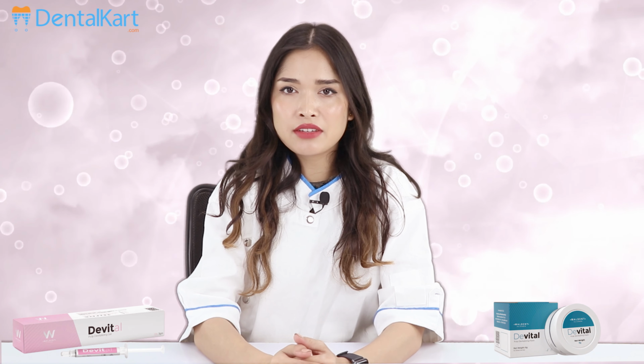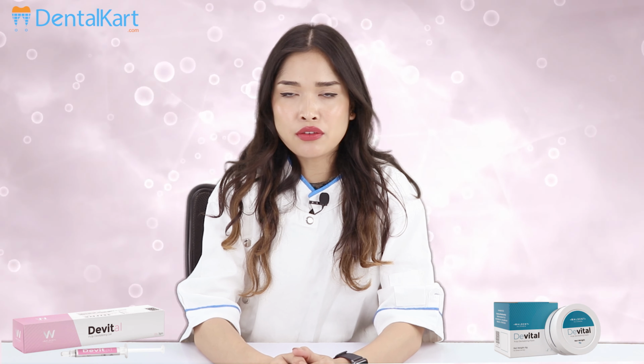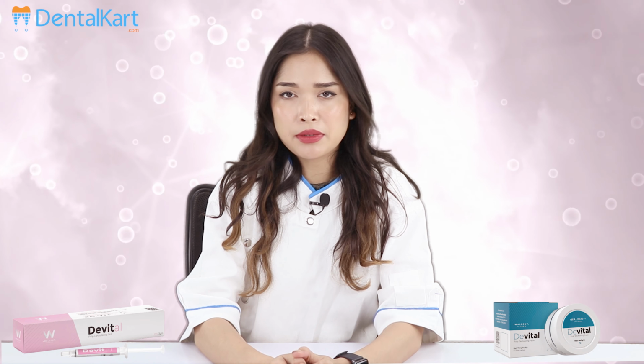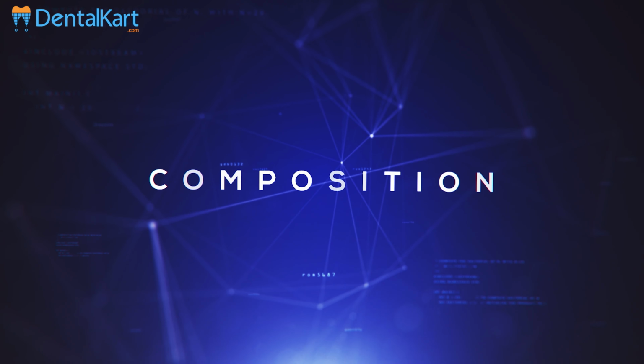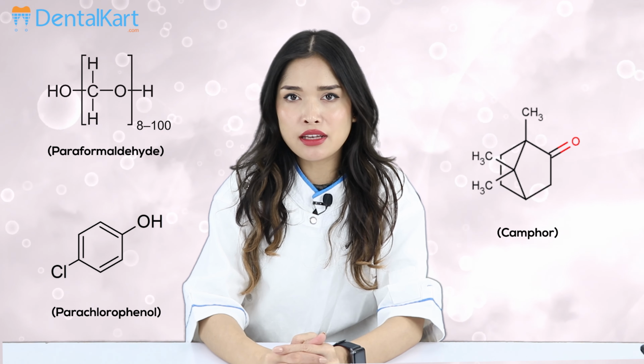Waldent Devital Pulp Devitalizing paste and gel contains paraformaldehyde as an active devitalizer that causes rapid mummification of the pulp and is used when anesthesia fails to be effective for pulp extirpation. It contains paraformaldehyde, parachlorophenol and camphor.